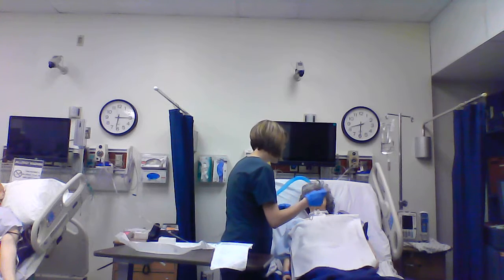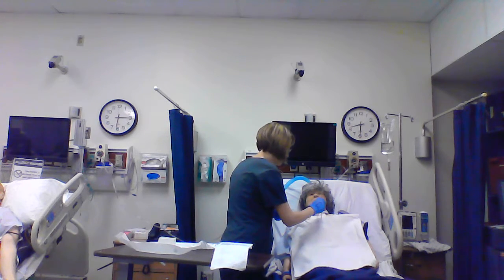Okay, Opal, we're going to begin. So I'm going to insert this catheter without suction into the tracheostomy down until I meet resistance, and then pull back up just slightly, and go ahead and apply intermittent suction while turning the catheter for about 10 seconds, all the way up, clearing the secretions.